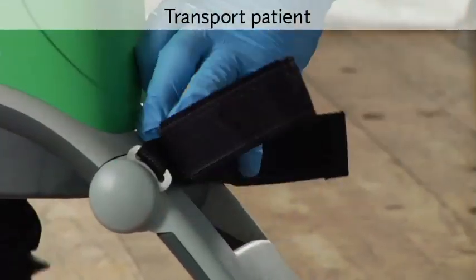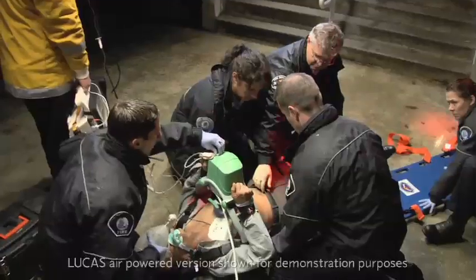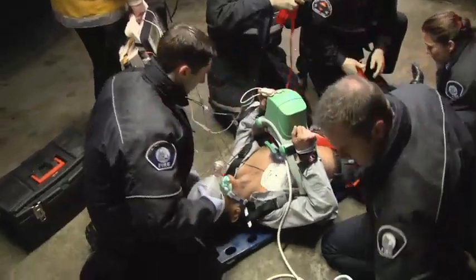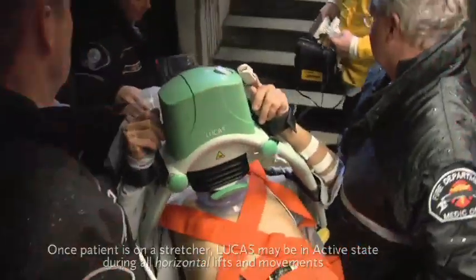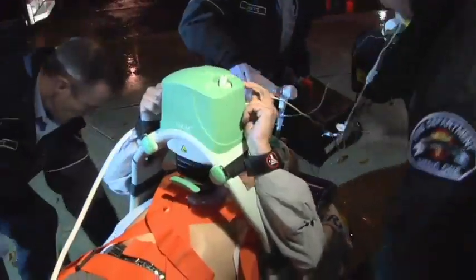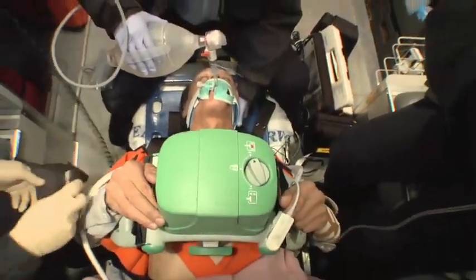When you transport the patient, you can secure their arms with the arm straps to get them out of the way while you work. Push pause to pause compressions while lifting the patient — at least 3 people should lift the patient and Lucas. Remember to support the patient's head even with the stabilization strap in place. Do not use the arm straps to lift the patient or the device. During compressions, make sure Lucas stays in the correct position and angle on the patient's chest. As soon as the patient is horizontal again, check the suction cup position, adjust if needed, and push active. During ambulance transport, the patient and rescuer should be secured. It's common for the patient to have bruising and soreness of the chest with use of Lucas.